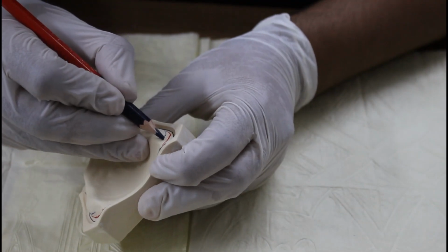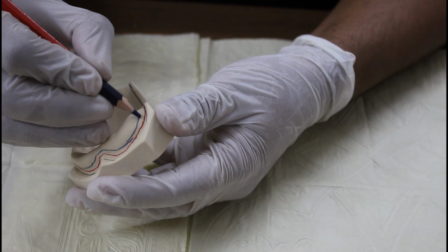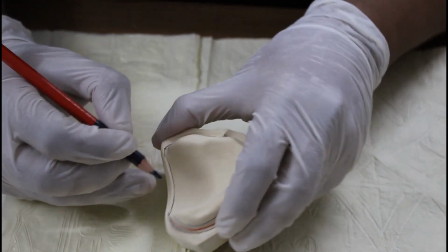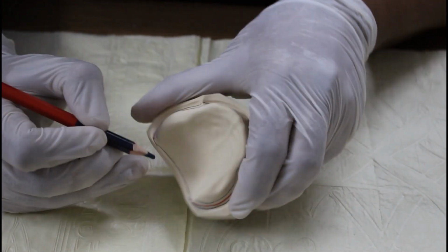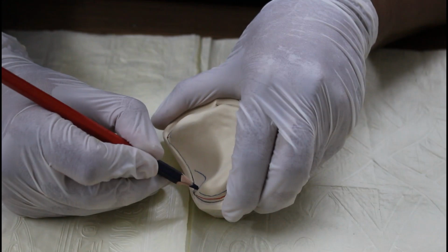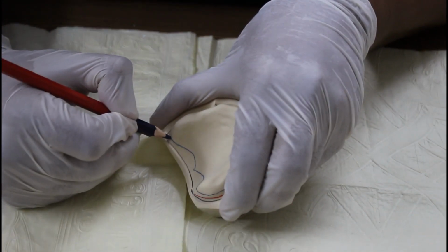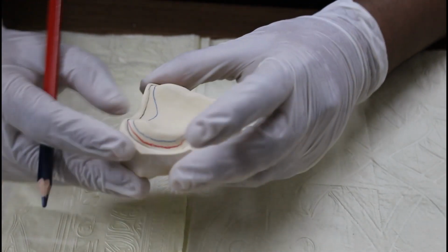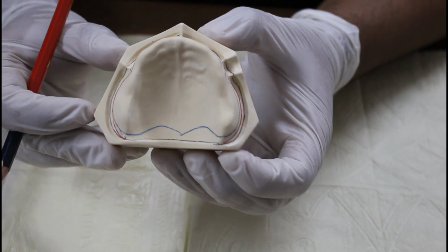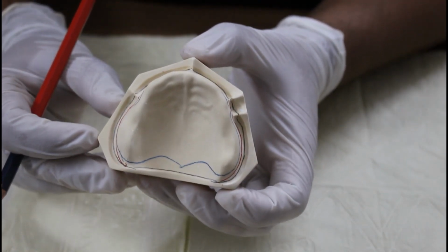It will be 2 millimeter above like this, 2 millimeter away like this, and in the center you will be making the posterior palatal seal area like this, which we marked in anatomical landmarks, and join here and here. So this is how your third line will be. This line is called the line for the wax spacer.